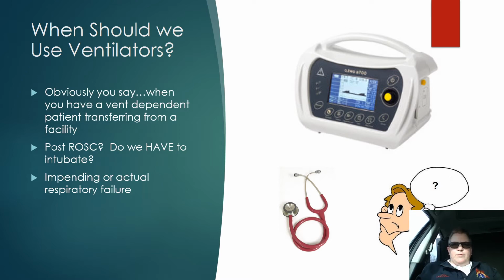Impending or actual respiratory failure. So we have a patient that we think we can turn around with CPAP or BiPAP, and using our ventilator can help do that. We can set a little bit better PEEP and pressure support if we need, so that their bodies can be supported, and hopefully we don't have to intubate those folks. So that's another use of our ventilator.